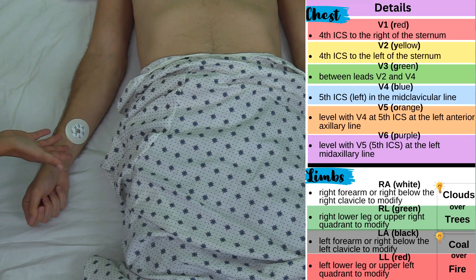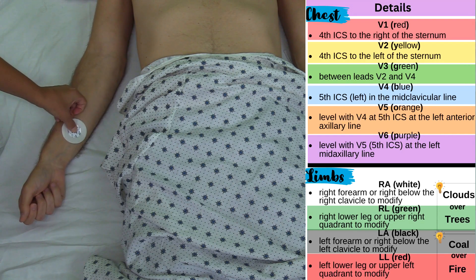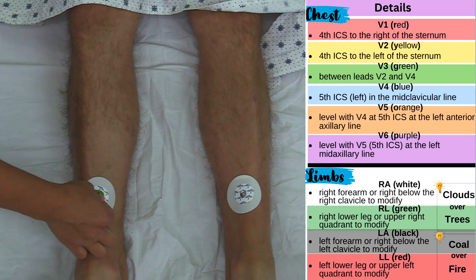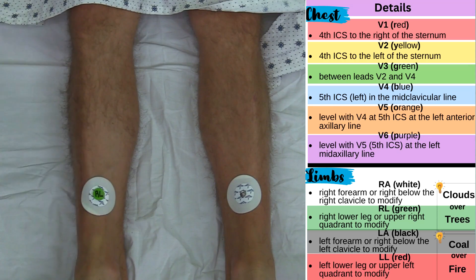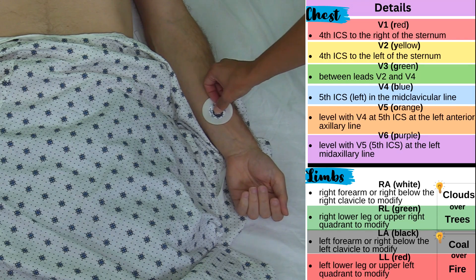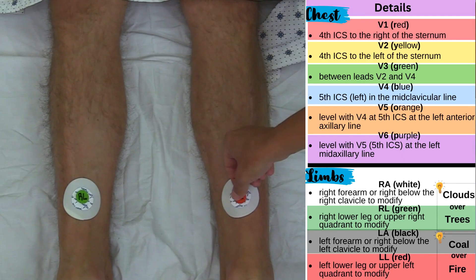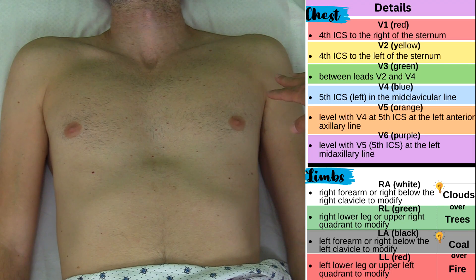Now let me go over the limb lead colors that you'll typically see. This can vary depending on the manufacturer, but typically the right arm is white. Clouds over trees — green for the right leg lead. Next is black for the left arm lead, which represents coal over fire — red for the left leg lead.